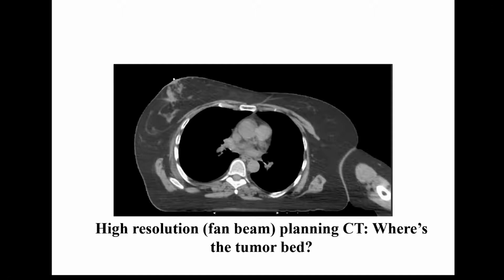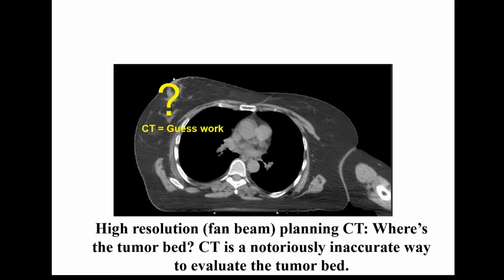So as we look at this high-resolution fan beam image of the breast, I would ask, where is the tumor bed here? It gets lost in the normal breast parenchyma. Next slide. And it's often a significant amount of guesswork in defining, based on just a CT image, what is the tumor bed that is to be boosted. Next slide.